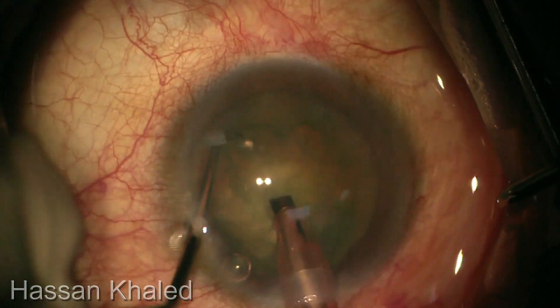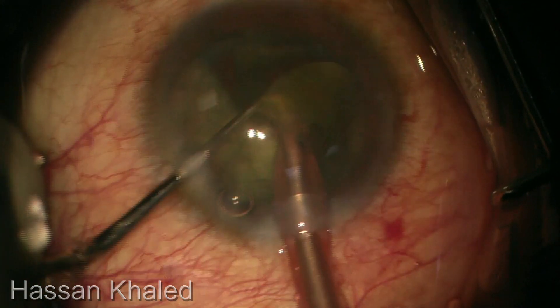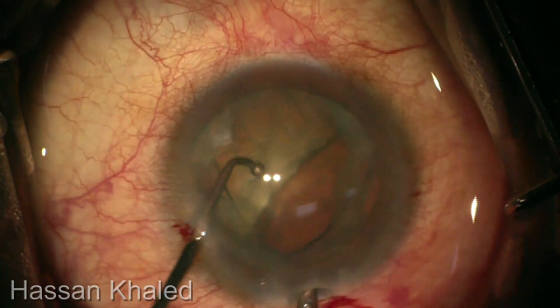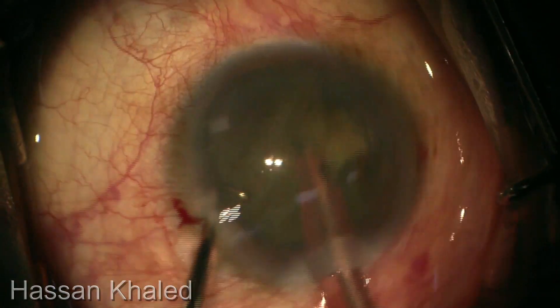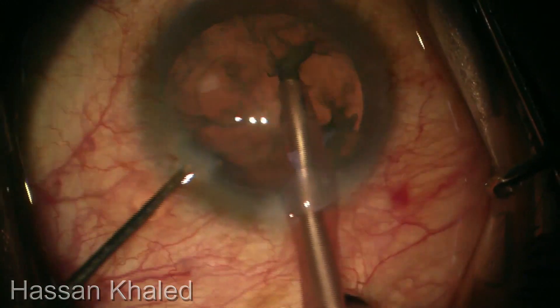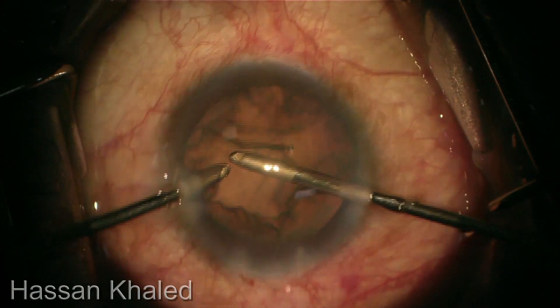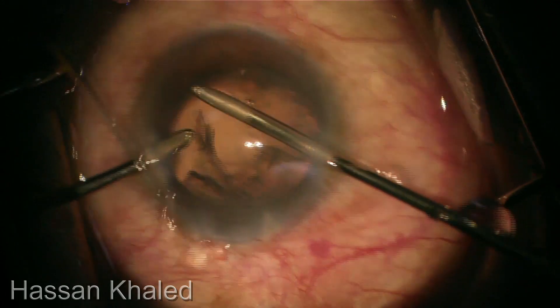Then doing the phacoemulsification — mechanical chopping of this cataract is important to decrease the amount of ultrasound energy. I'm trying to emulsify this cataract as far away from the back of the cornea as possible. Periodically applying dispersive viscoelastic to protect the endothelium of the cornea is a crucial step during the surgery. Here is the last piece of this cataract. It is also important to avoid hitting the back of the cornea with irrigating fluid while removing the cortex, to decrease stress on the corneal endothelium.